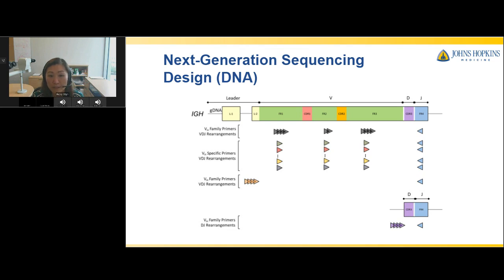And then one advantage of genomic DNA is that even non-productive alleles can be detected. Remember before we had talked about DJ rearrangements preceding VDJ. If that initial DJ rearrangement is unsuccessful, that allele is actually aborted as an incomplete rearrangement. So the evidence of that DJ allele could actually be recognized on the genomic DNA level and could be detected with non-coding sequences upstream of the DJ and overlapping with the D gene itself to amplify these very small incomplete rearrangements.